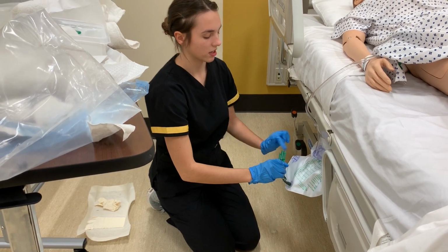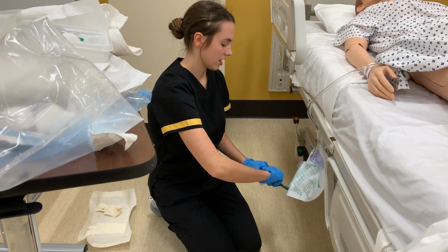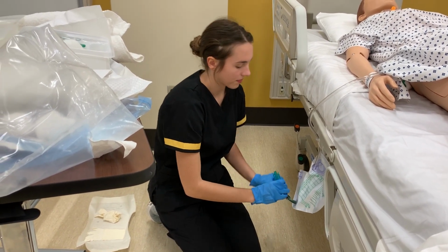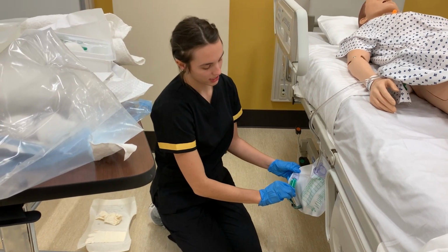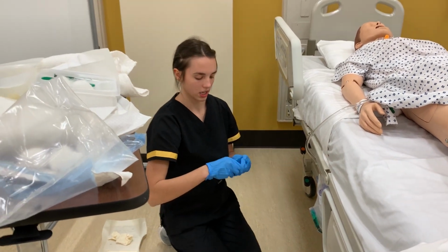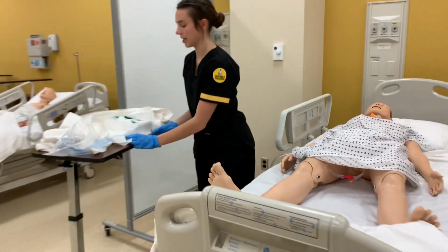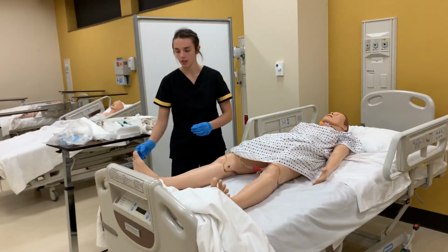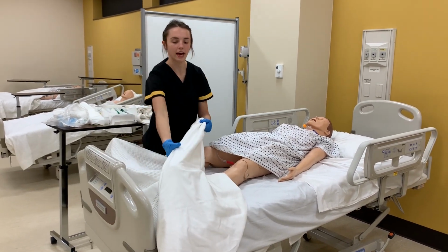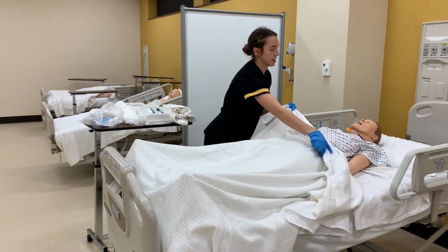So I would take it out, clean it with an alcohol prep pad, unclamp it from down there, and let it fill the cup, reclamp, and then clean it with alcohol one more time before putting it back in there. And then we would close up our sample and send it to wherever it needed to go in the hospital. And so the insertion is complete. We have urine returning into our bag down here.